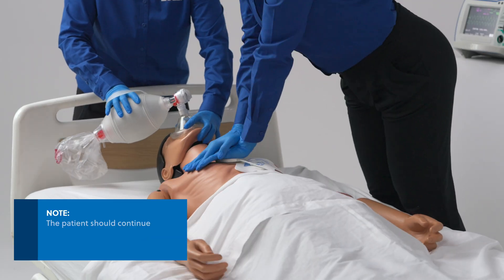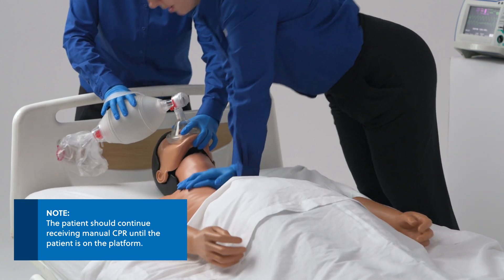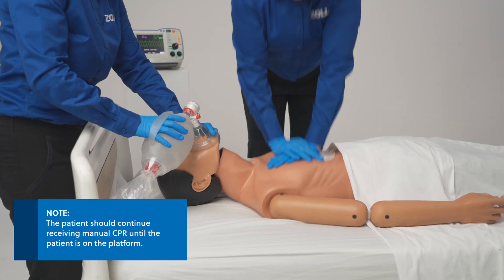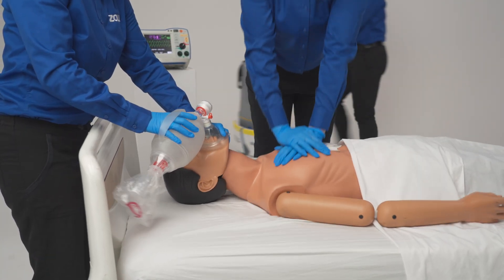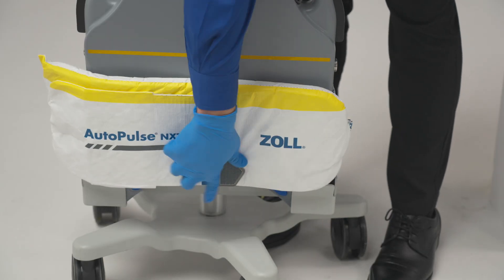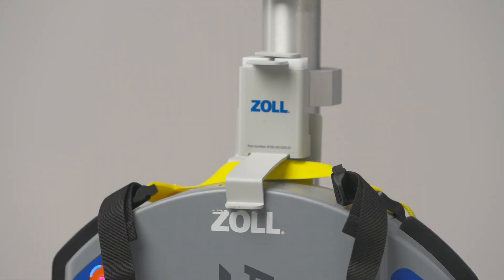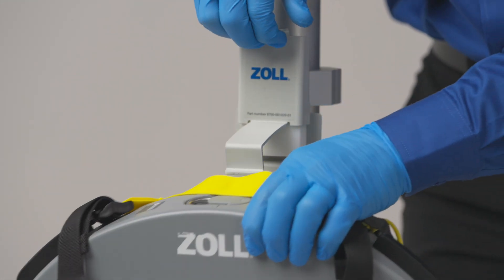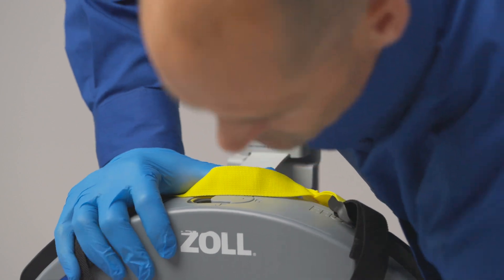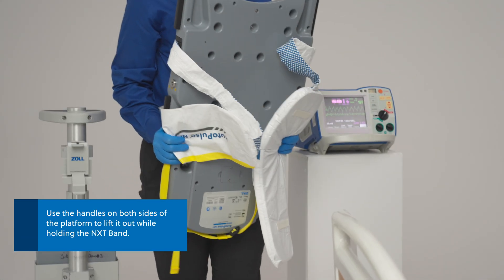Note that the patient should continue receiving manual CPR until the patient is on the platform. Open the AutoPulse NXT band. Remove the platform from the transporter by lifting the front hook at the top of the transporter, and use the handles on both sides of the platform to lift it out while holding the NXT band.